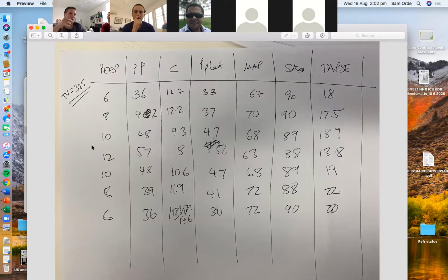I think if you're doing this, I keep my hand in the same position at all times. So it's a 2-person technique where I just keep my hand there. If you're doing it by yourself, you've got to make sure you've got the ventilator within easy reach. So I use my top 3 fingers, I find a view and I just stick with that. And then I change the ventilator, and you've got your sheet of paper and write it in front of you. But your hand always stays in the same position to try and make sure you're comparing eggs with eggs.